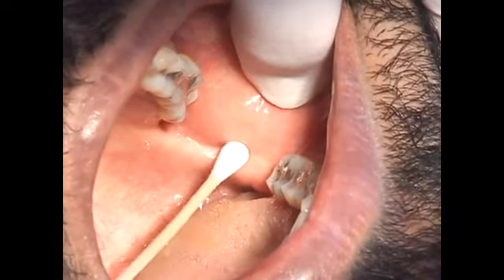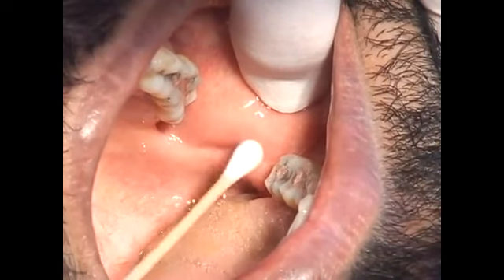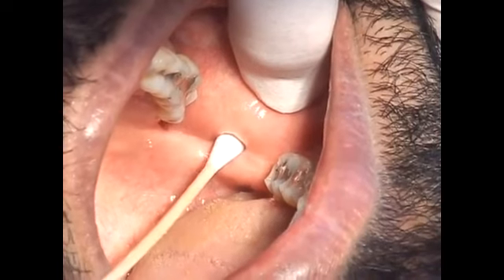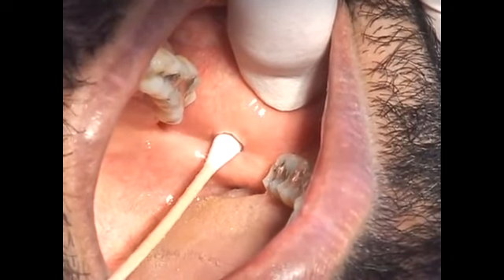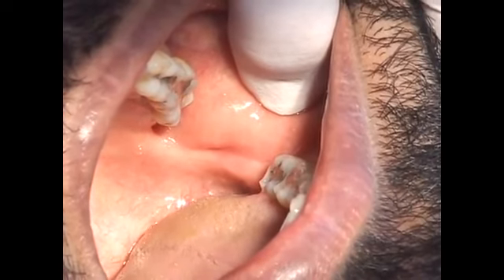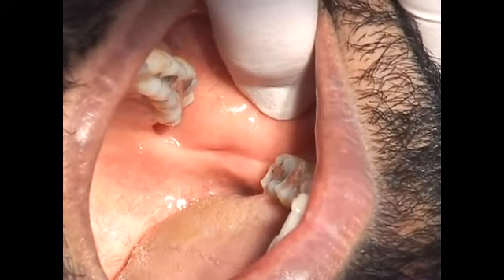Just lateral to the raphe, there is often a shallow depression or fossa, which feels soft and spongy. This depression is approximately 1 centimeter above the occlusal plane, or halfway between the maxillary and mandibular occlusal planes.